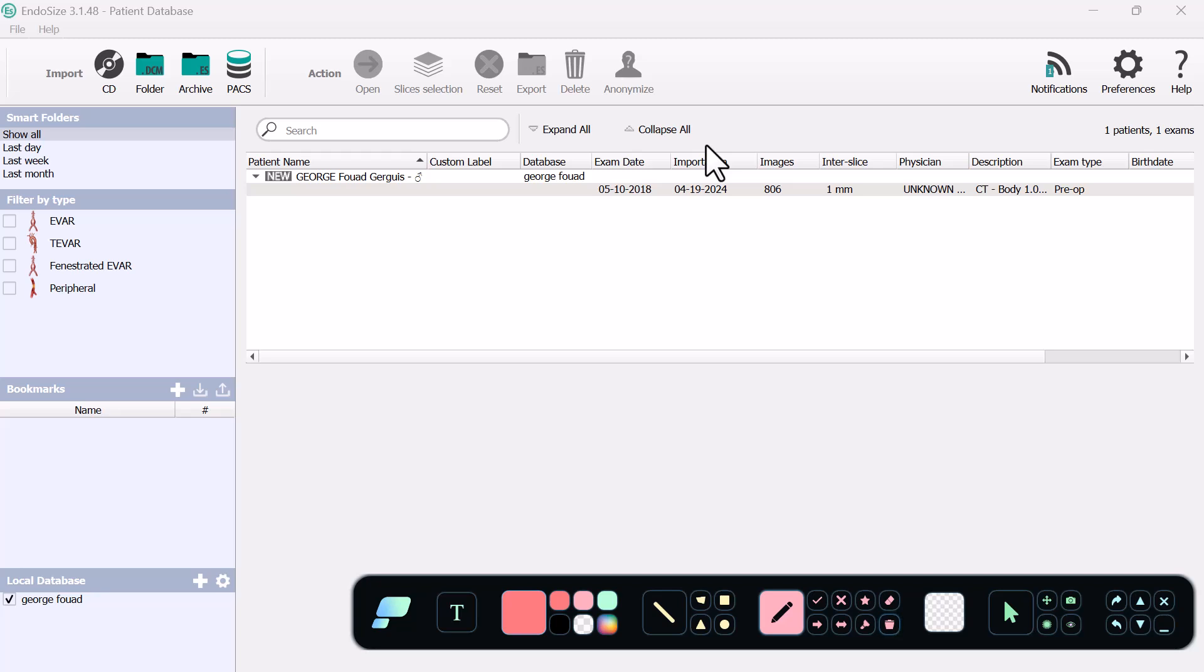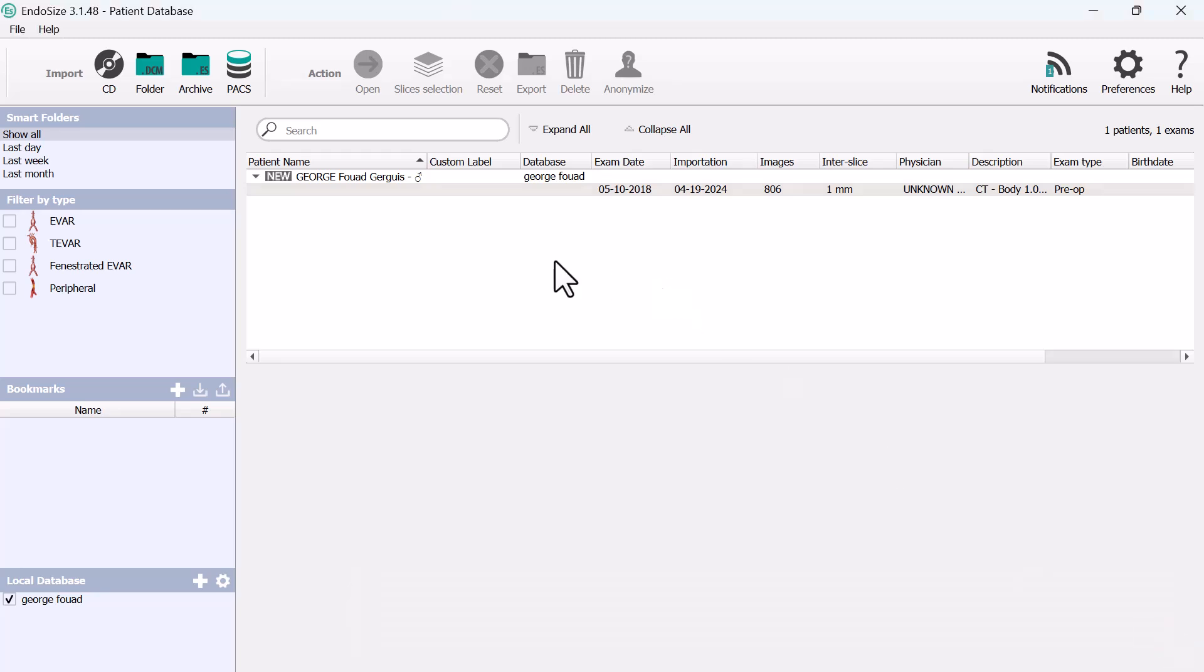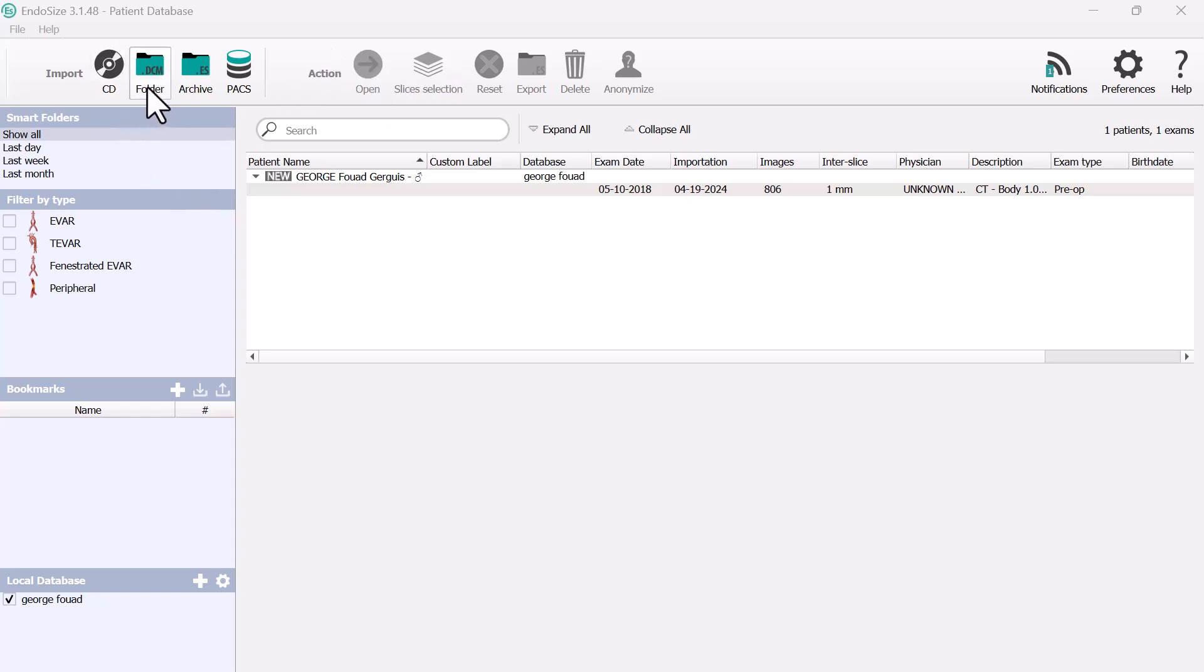So let's say, for example, that this patient you have booked to do an EVAR by tomorrow. You can see that here you can import the data from CD, from folder, from archive.